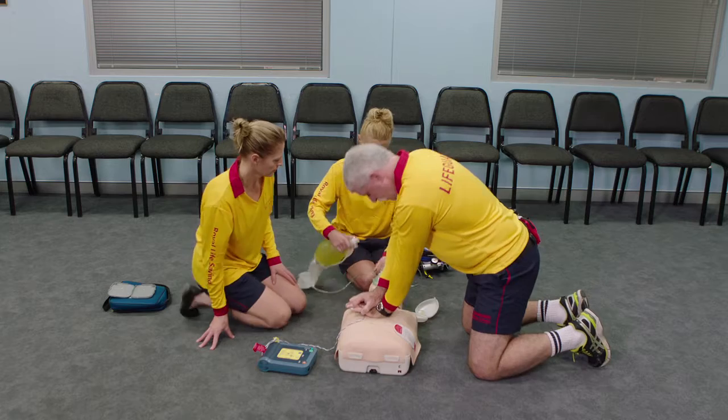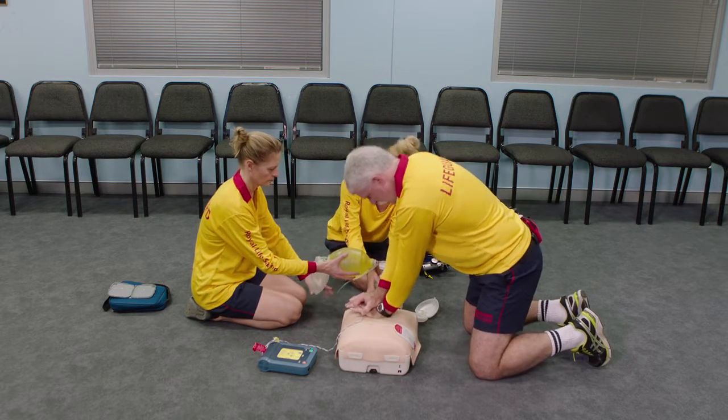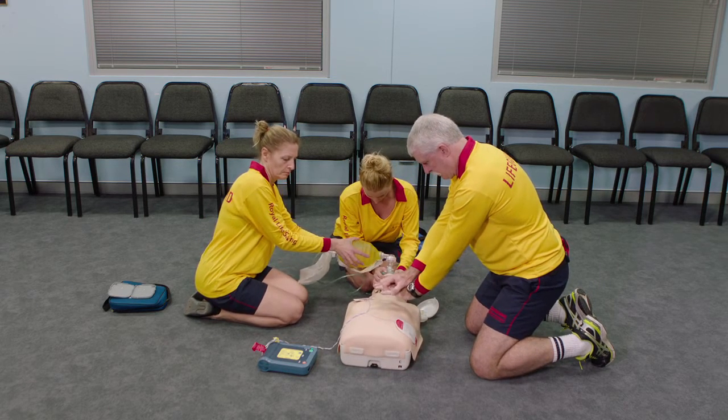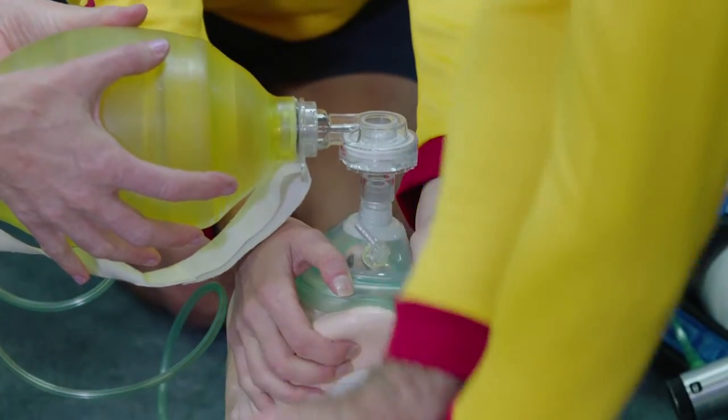The positioning of three lifeguards providing oxygen resuscitation is one on either side of the body and one above the head. For effective ventilation, tilt the head back and seal the mask against the face.